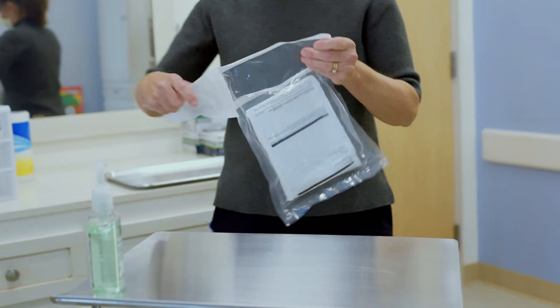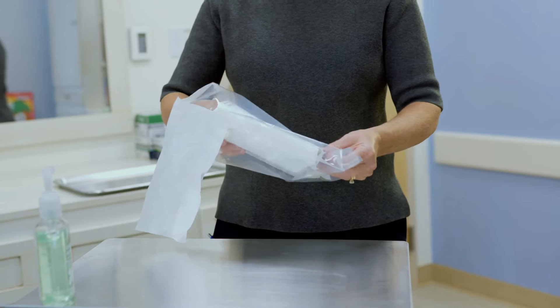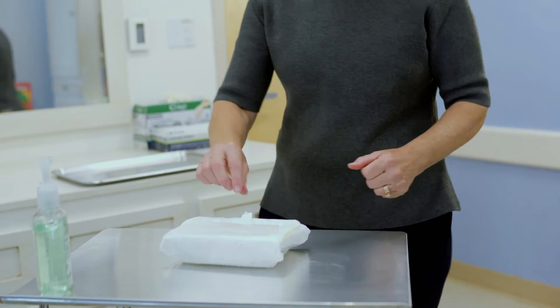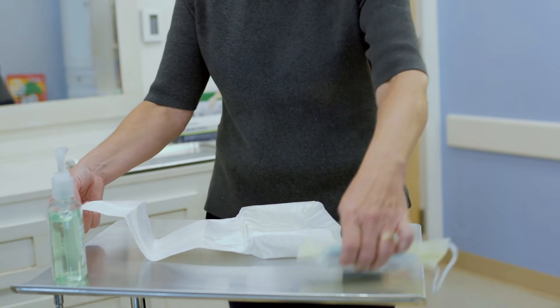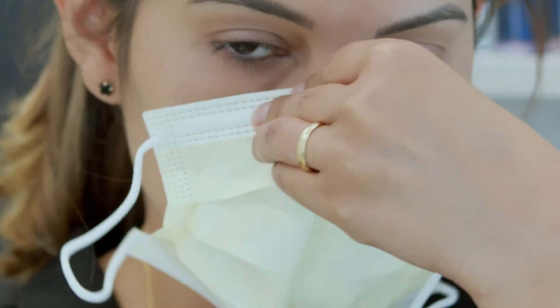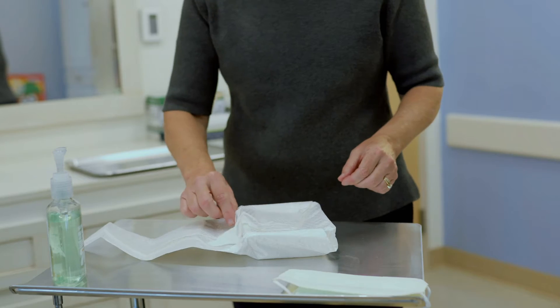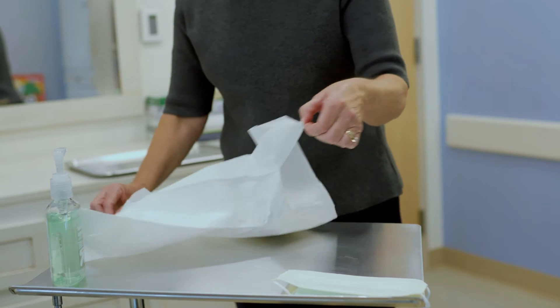Unwrap the kit, only touching the edges of the package. Carefully reach into the package to get your sterile gloves and set them aside. Put a mask on yourself and anyone else in the room. Clean your hands again. Open any additional sterile supplies and drop them onto the sterile area.